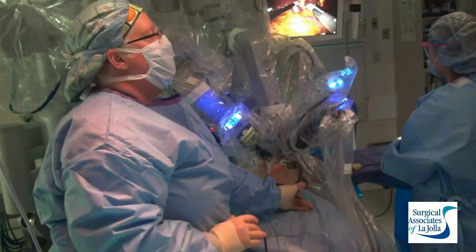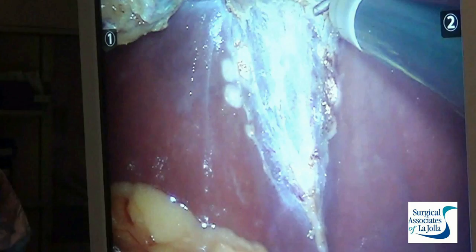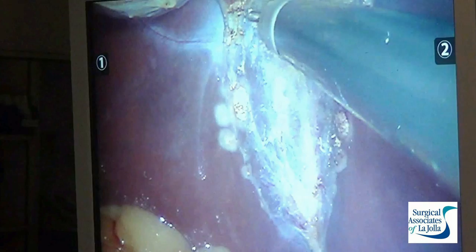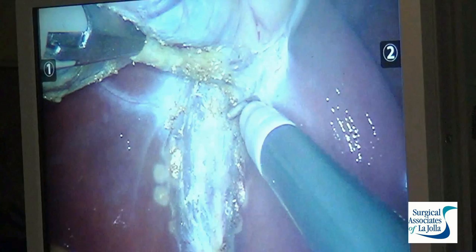The dissection is progressing. We've identified the cystic duct which leads from the gallbladder. I've placed clips and we've transected the duct and the artery, and now we're separating the gallbladder from the liver, taking down these mostly avascular attachments — though sometimes they do bleed. The da Vinci system typically allows for very minimal blood loss, and we just progress along.